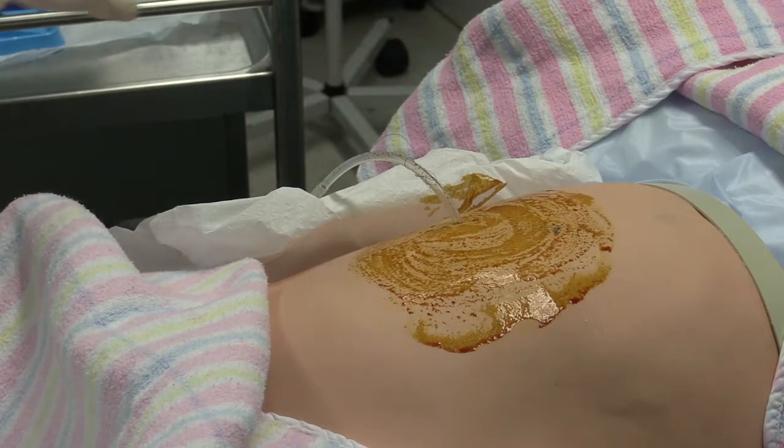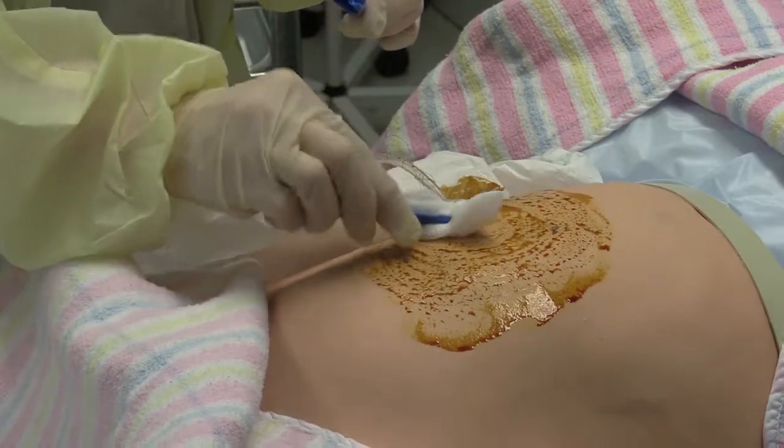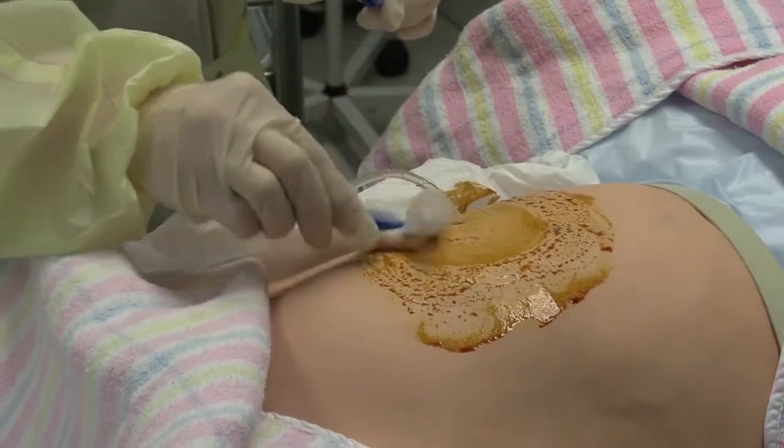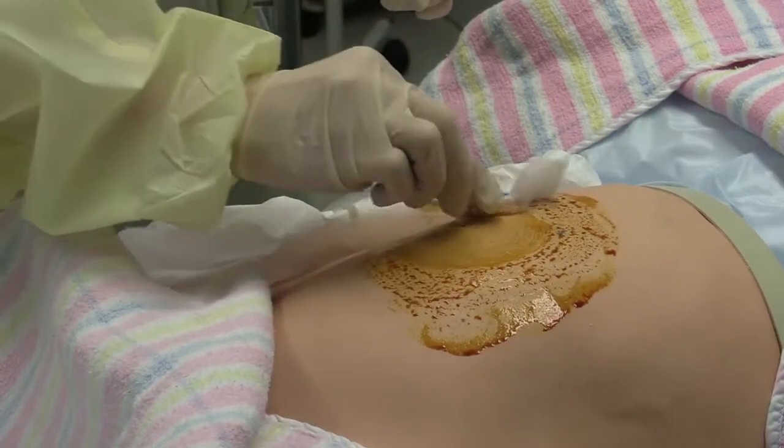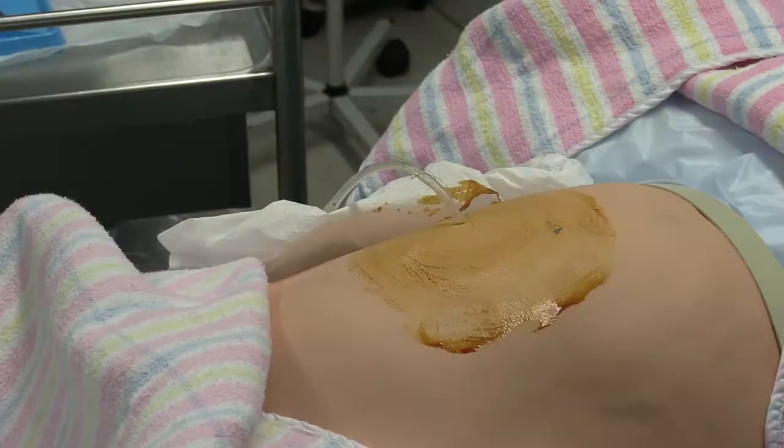Then we need to let the betadine dry off for about 2 minutes for the solution to be effective. Make sure that the skin is really, really dry, otherwise the catheter dressing won't stick. So I'm just going to dry it off. So that's nice and dry.